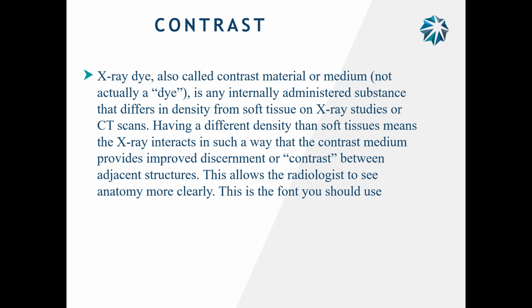No, it blocks the X-ray. So the film that you're seeing is a negative. The dark is what's going to be soft tissue, and the white is going to be bone or hard tissue. Now, that's not very good for looking at muscles, veins, arteries, and such, is it? Because the X-ray blows right through the veins and arteries and soft tissue and only shows the hard tissue.